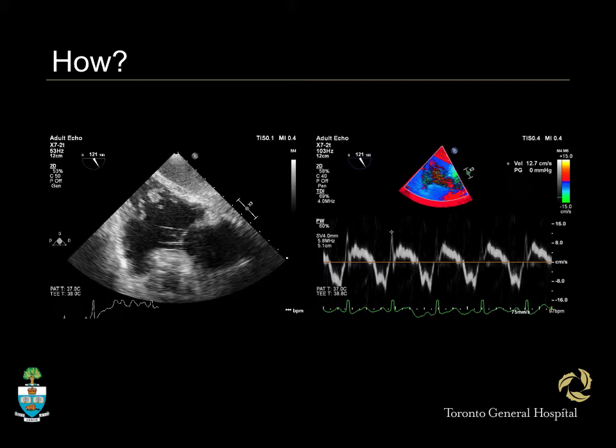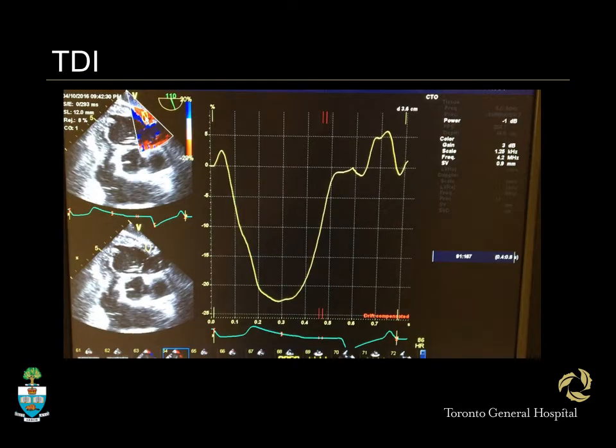and it correlates with right ventricular function. How can strain be measured at the level of the myocardium next to the tricuspid valve? You can use a function that's only available on the GE system, as far as I know, at least from the systems we have. You put a gate, or an area of interest, on the myocardium where you want to measure the strain.